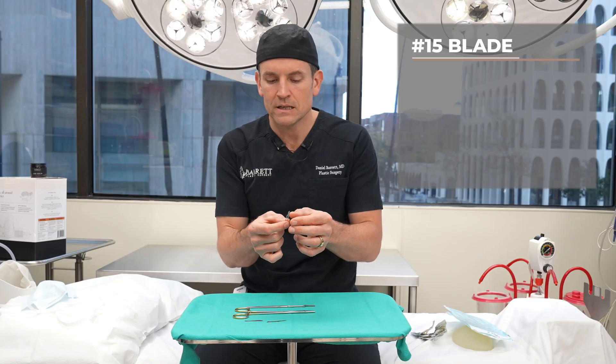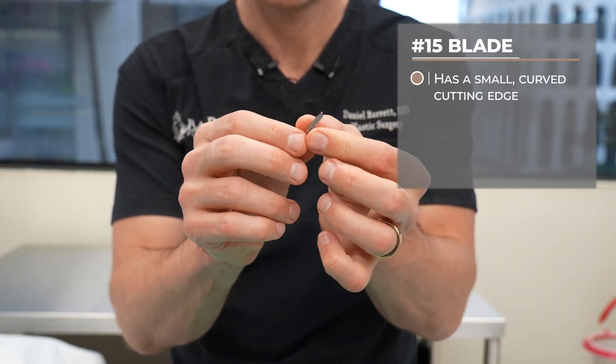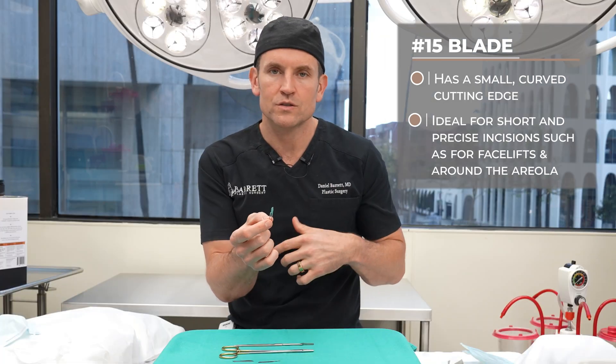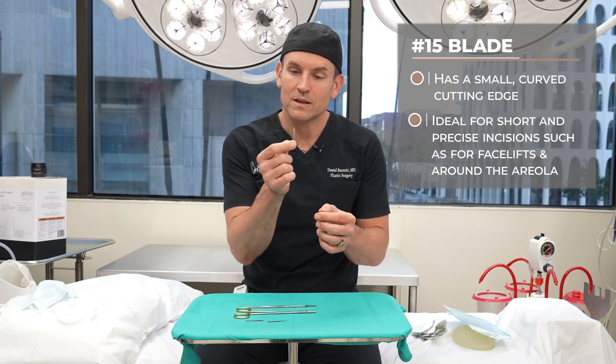The last one is a 15 blade, and this is a smaller, more refined scalpel blade that we use a lot of times in plastic surgery for very refined cuts — making facelift incisions, small incisions around the breast and the areola. I don't really have a great way to remember this, but if you do, let me know.